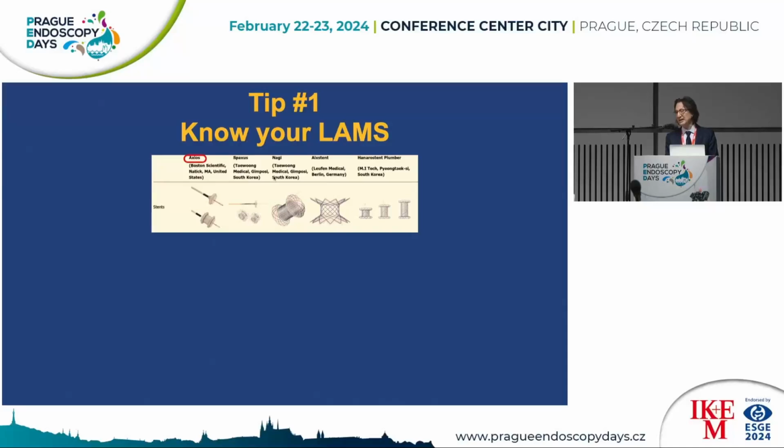The Nagi stent, I did some work with Anthony Teo from Hong Kong earlier, and we tested in benchtop studies the pull-out strength of the various stents, and the Nagi stent did not have the pull-out strength that Axios and Spaxus have. I'm not familiar with these stents. This other stent does look a little bit like the Axios stent. Whichever stent you use, I strongly recommend that you deconstruct it, and I'm going to do that with the Axios with you today.